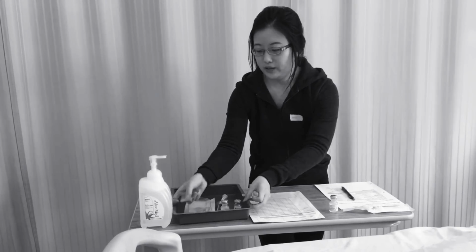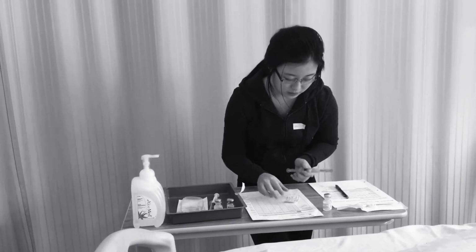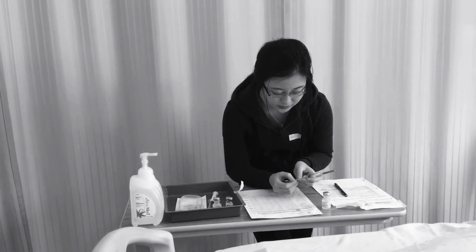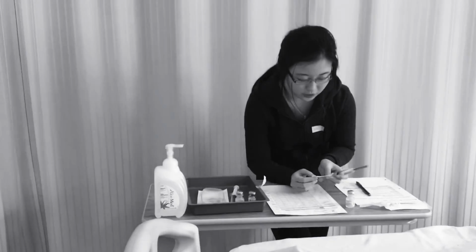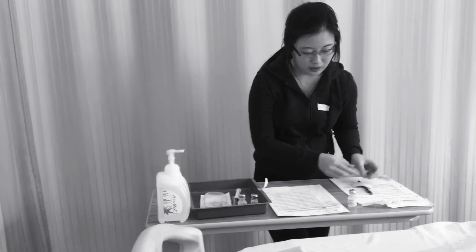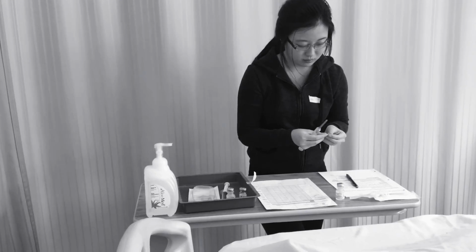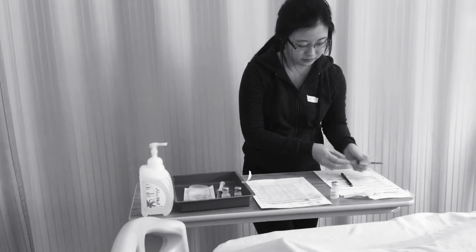So now I'm going to make a label for the syringe. So my patient is Tyrone Banks. I've made a label before this video, so I'm just going to compare it. Hydrocortisone, 200 mgs, 10 ml in here. Diluent was 8.4, which I added. And date is February 13th, 2018, and it's currently 10 a.m. And I've signed it, so I'm going to put that here. Okay, I'm going to put that there.